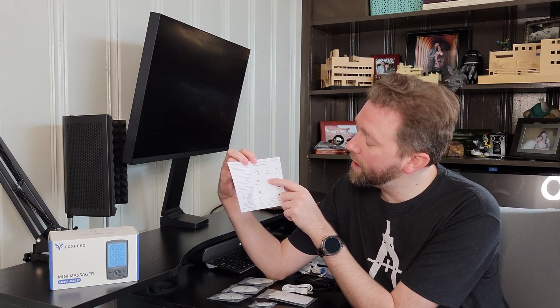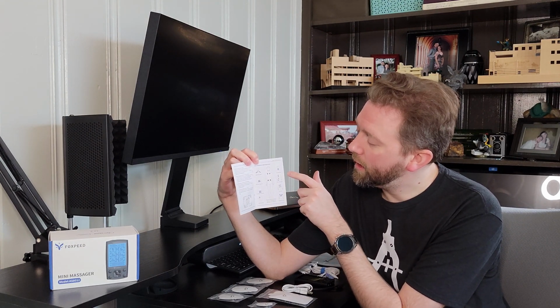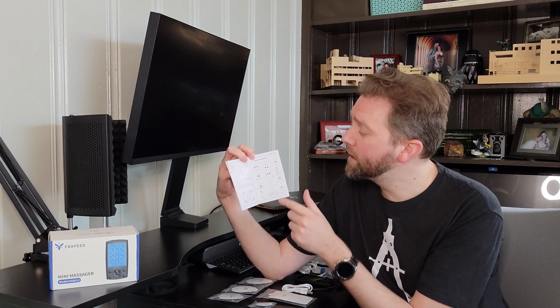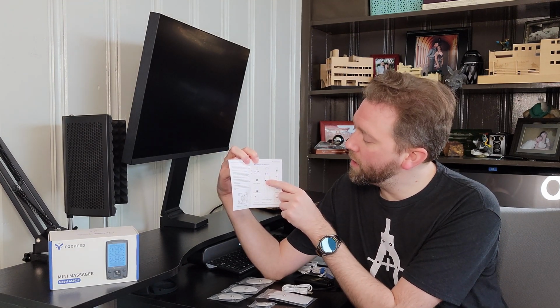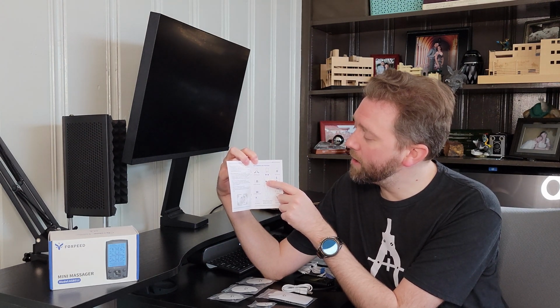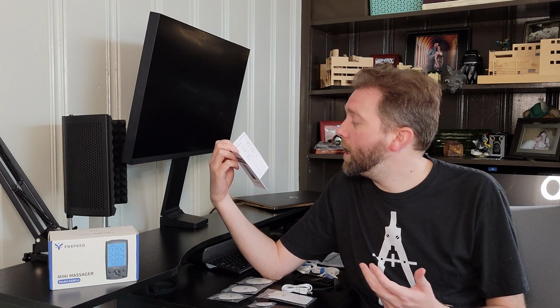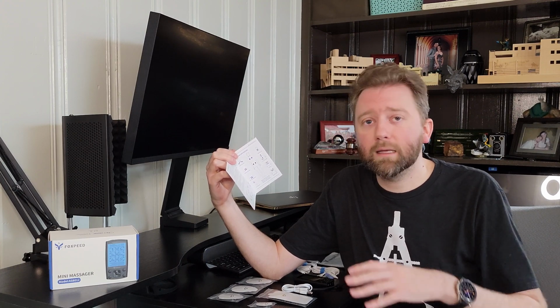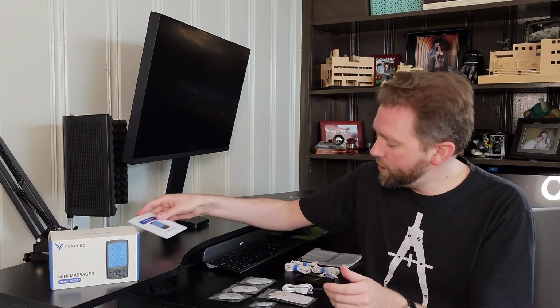They probably should have picked other colors, but that sets up how you want to place the little pads. It's important. You don't want to cross the body, so you would put one here and one in the matching spot straight down. You don't want to send that electric pulse through your heart because you don't want to mess with that heart rhythm. And also, if you have a pacemaker, this device is not for you, because once again, it all works by sending electric pulses. So be sure to check out the little manual.